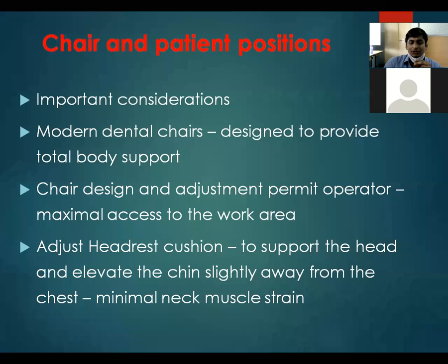Adjust the headrest cushion. Headrest adjustment for the patient is very important to support the head and elevate the chin slightly away from the chest. It will give minimal neck muscle strain. Your head should be properly rested on the headrest of the chair, and the chin should be slightly elevated so that there is minimal neck muscle strain.